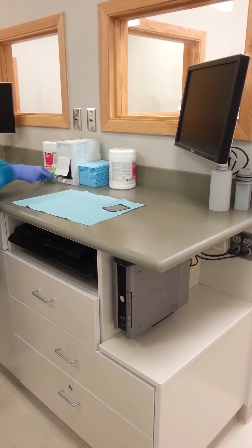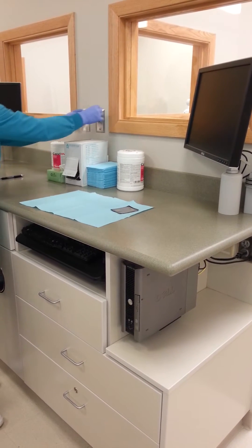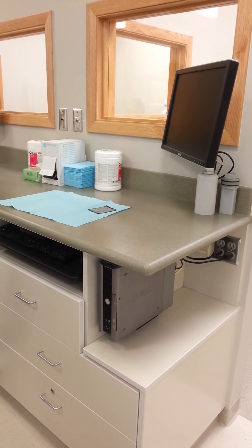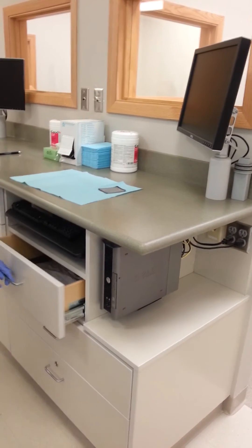Next we need to place the barrier film over the exposure switch. Once our operator station is set up, we need to set up the patient's room by placing the bag over the patient's chair.